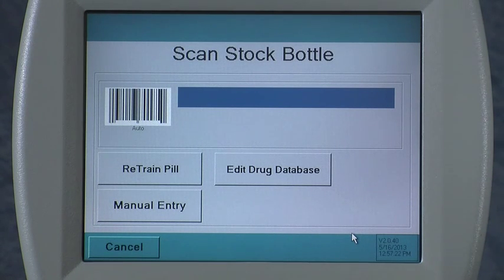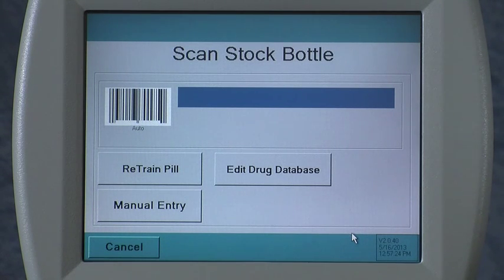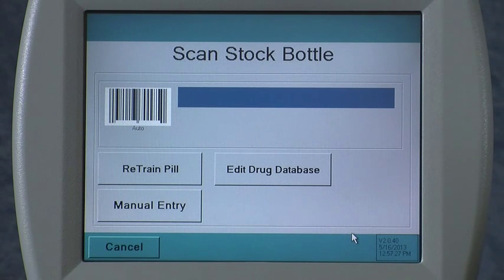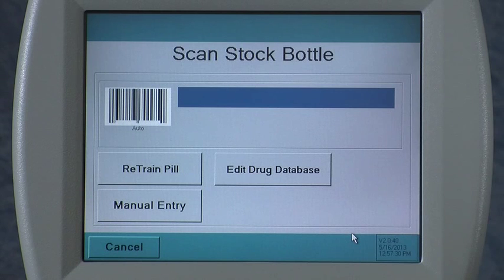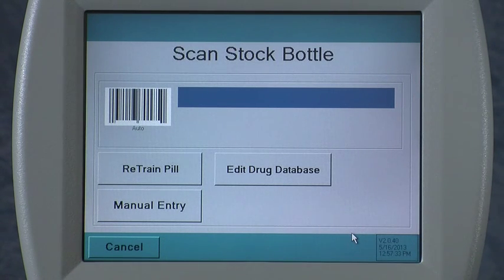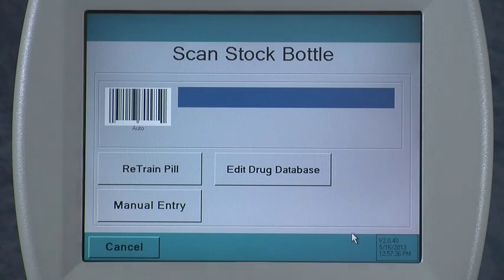In addition to that, the ICON maintains a trained image of every drug that it can count, and we have over 50,000 NDCs covered with trained images as well. However, if you come across a drug that needs to be trained on the ICON, it's a fairly simple process.